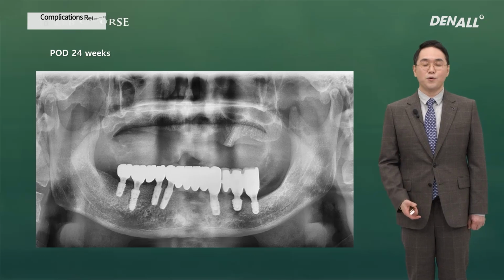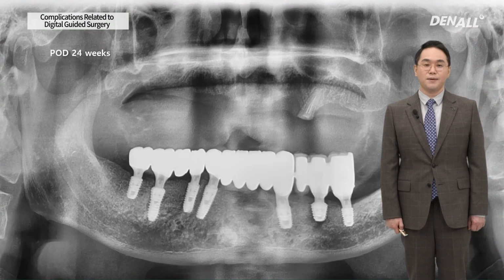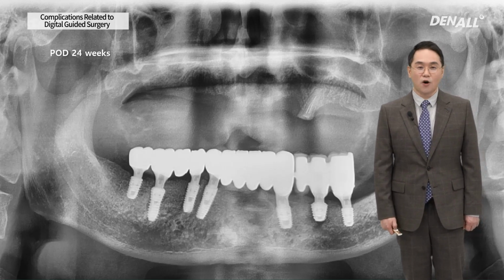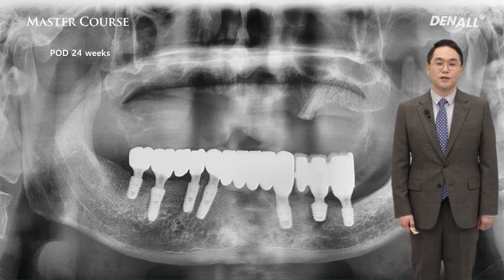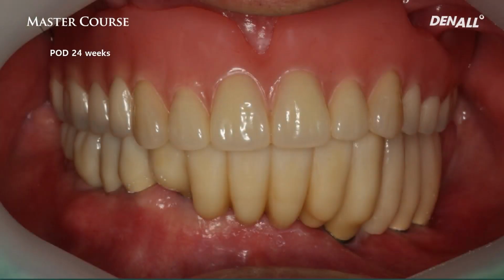At first, I planned to use 6 implants to provide a fixed prosthesis, but a total of 7 implants were placed and 3 implant failures were experienced by this patient. This is post-op 6 months. This is the panoramic image after the final prosthesis.